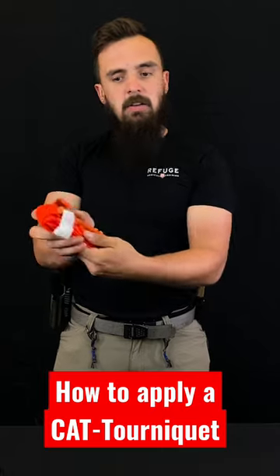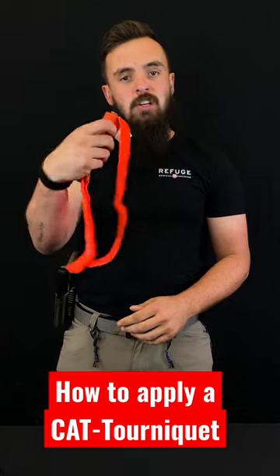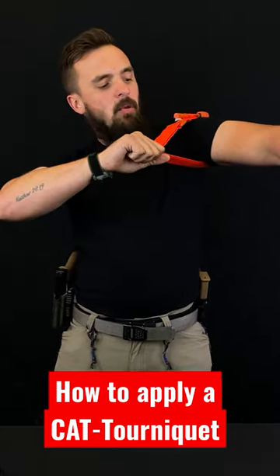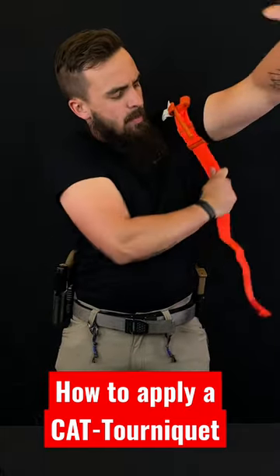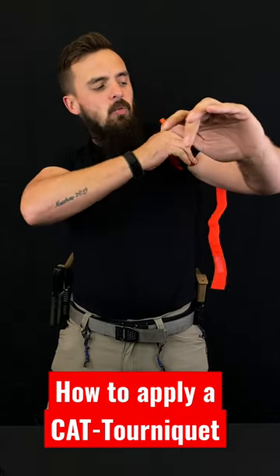So what you do is you take your tourniquet, you put your thumb on the C-clamp and you can easily flip it open with just one hand. After that you're going to go above your limb high and tight, pull away from you and cinch down. After you cinch down and start your hook and loop, that's when you can begin to work your windlass.